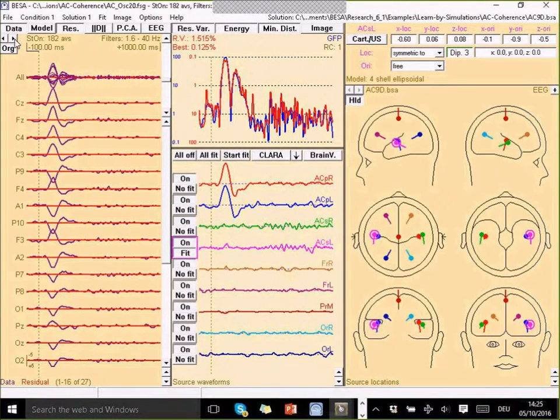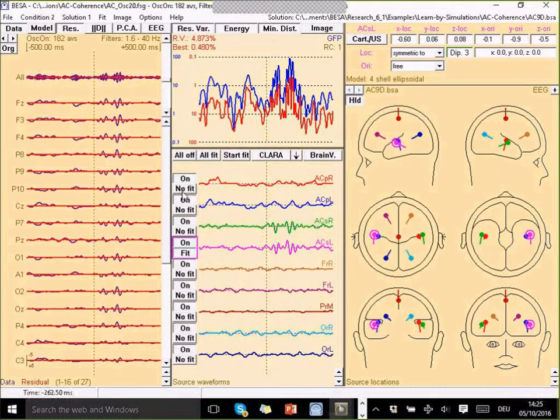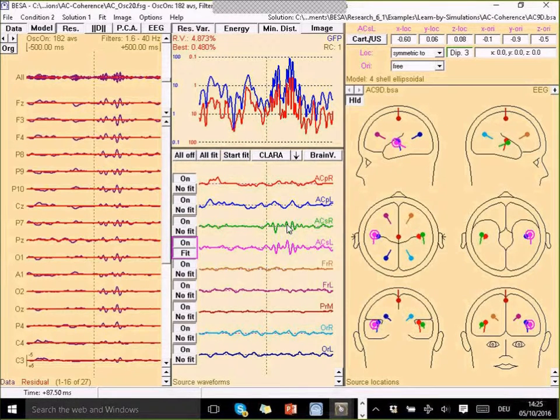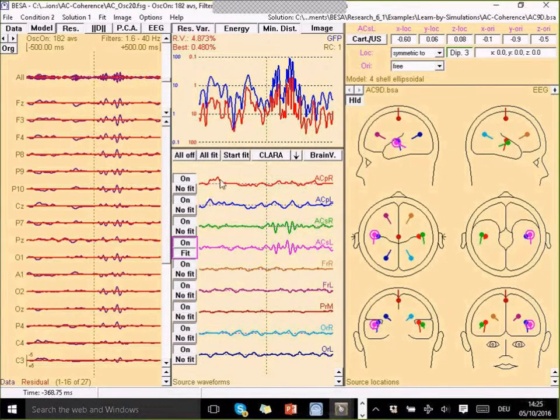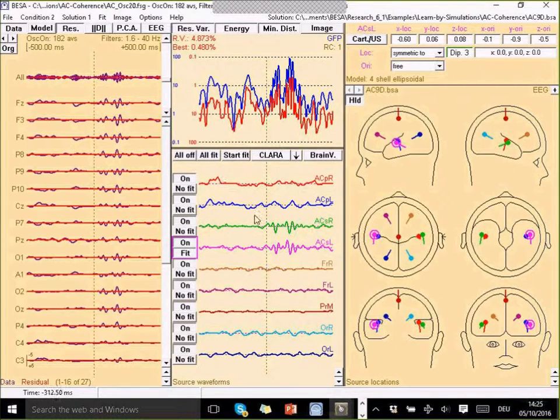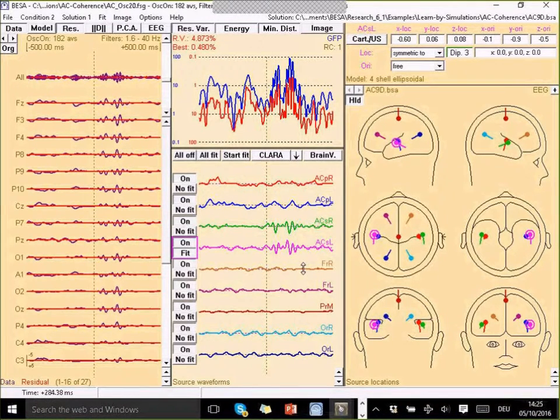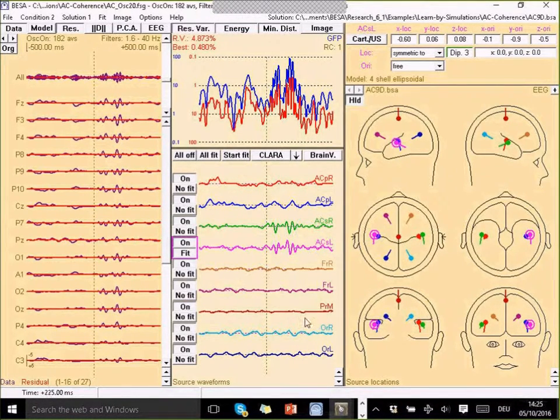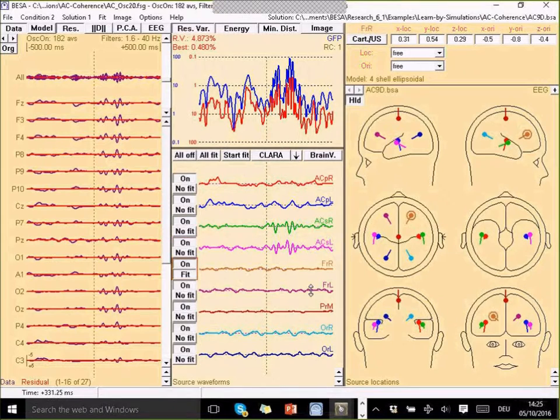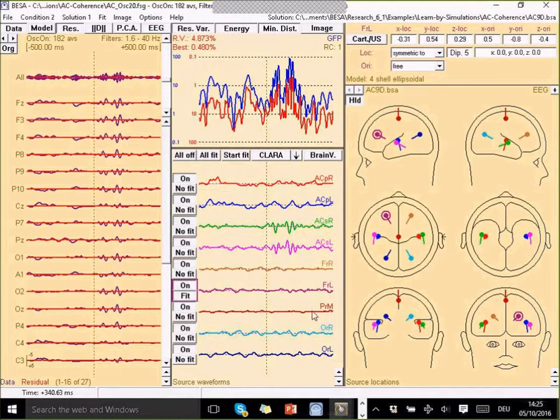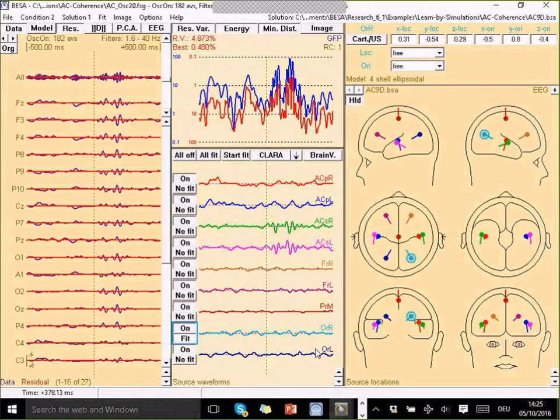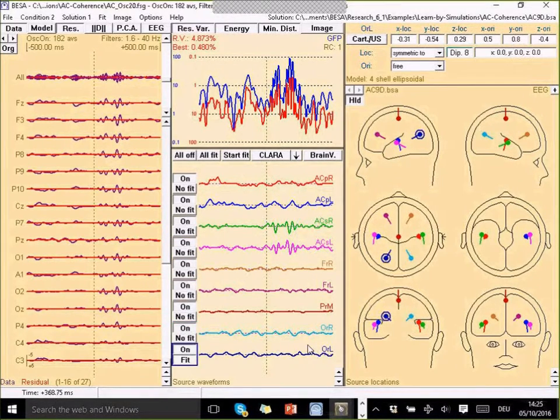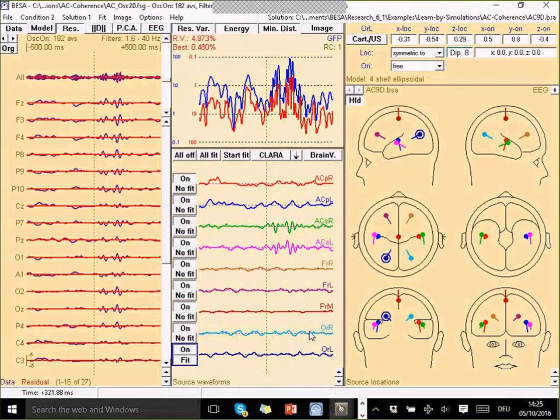If I trigger my average according to the oscillatory response, I can see some activity here, but not very much before in the first two sources. Then I've got my other five sources here later that should simply summarize any other activity that goes on in the brain.